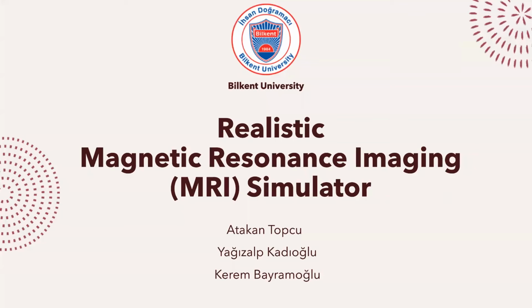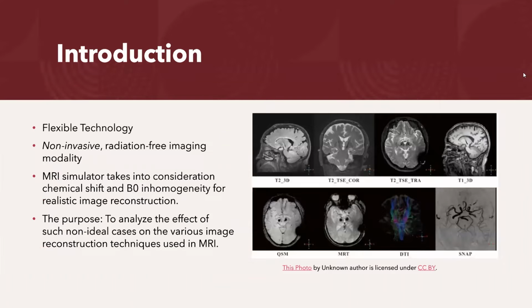Hello, my name is Atakan Topcu, and with my teammates Yağızalp and Kerem, we will demonstrate our realistic magnetic resonance imaging simulator for our medical imaging course. MRI has been a popular modality for recent decades due to its flexible functionality, as it can pick out different features in the image using different modes. And also, it is a non-invasive, radiation-free imaging modality.